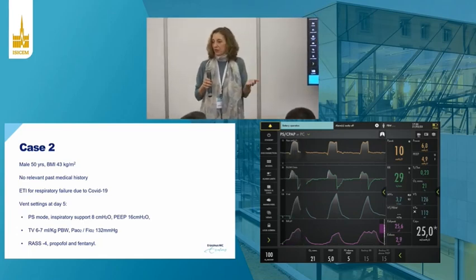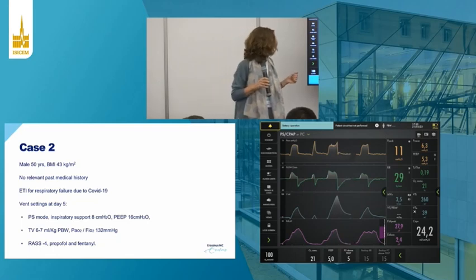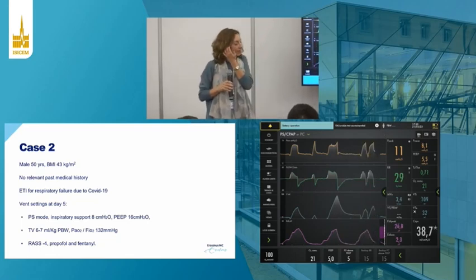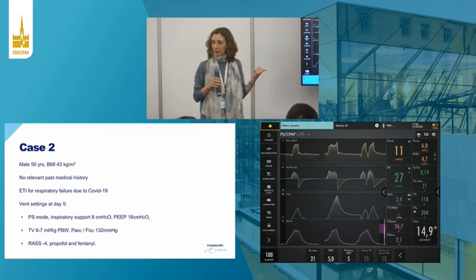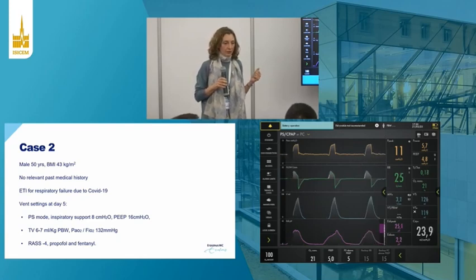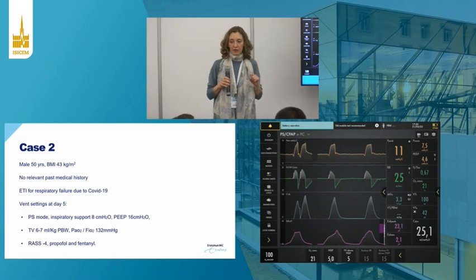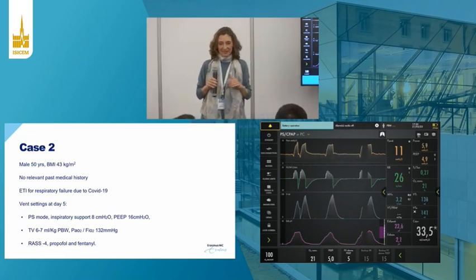We have a natural breathing variability when we are in assisted mode, and it can create a problem sometimes. But our tools to solve it are these 2. Increase the level of assist if appropriate, or increase inspiratory time by decreasing the cycling off criterion. Okay, the first move is cycling off criterion and then increase assist.